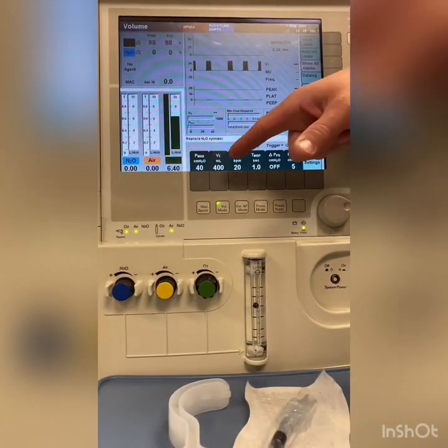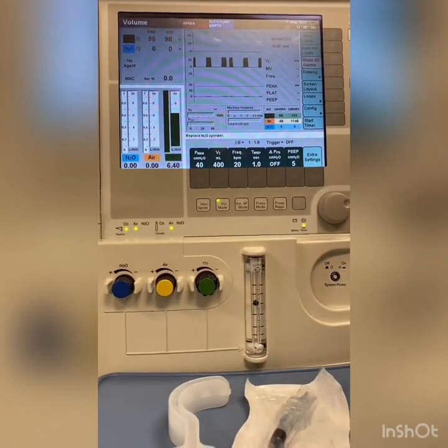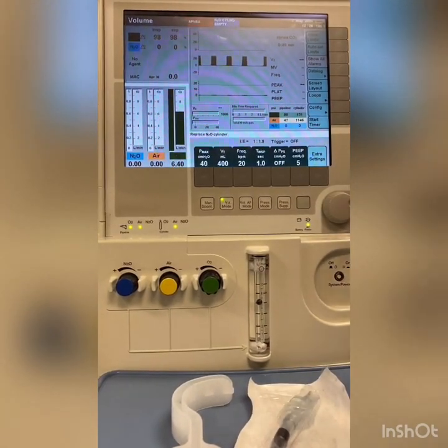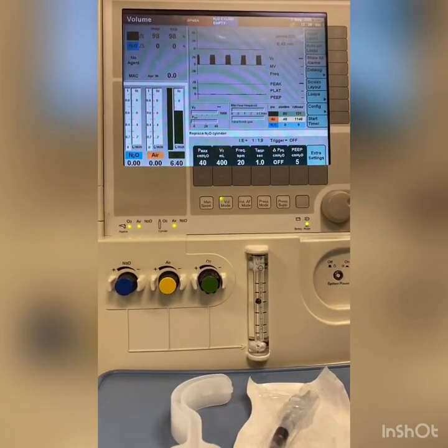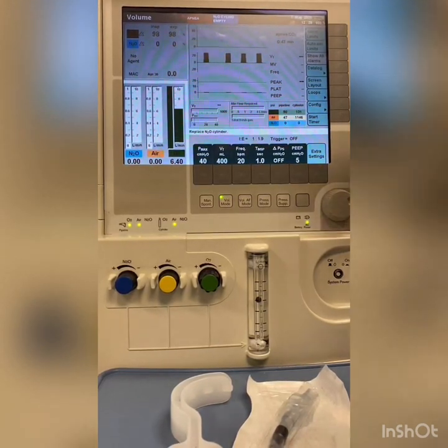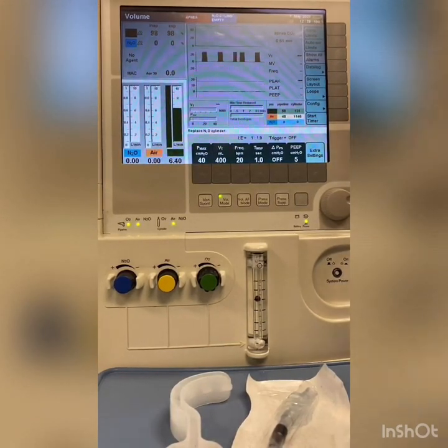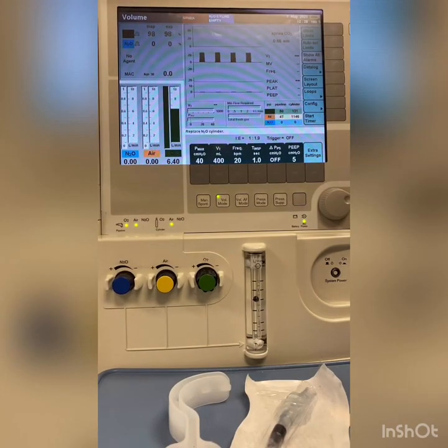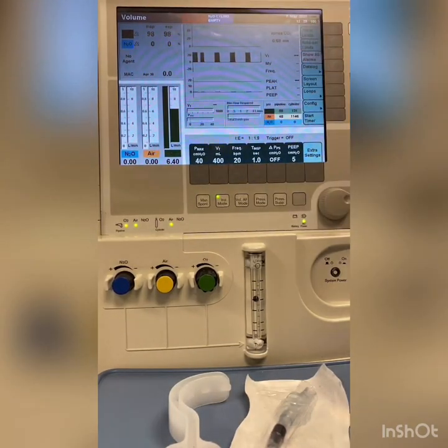I don't want to get too much pressure going in patients for barotrauma. I don't want too little pressure for atelectasis. That's why the PEEP is going on. And I hope that is helpful to at least get some basics in maintenance of your case. Also the emergence and induction part with your ventilation component.